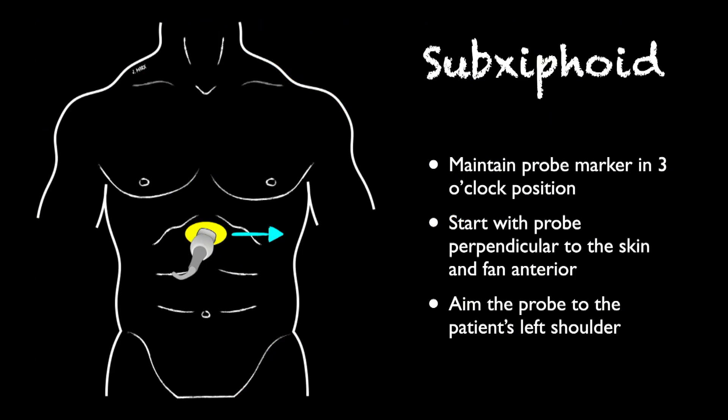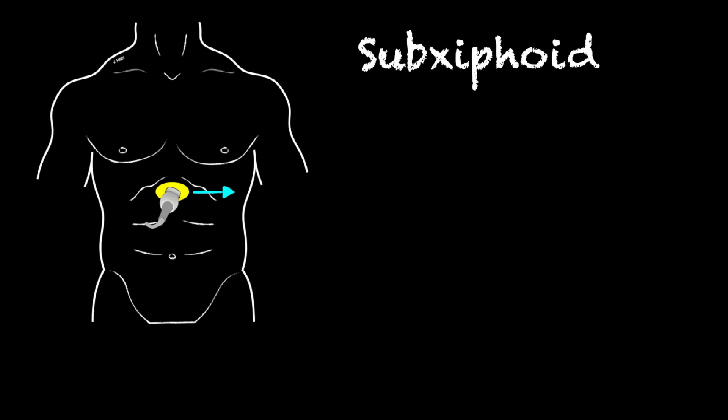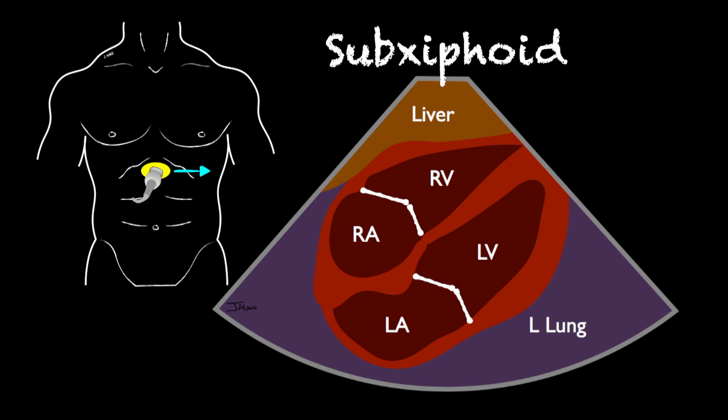To get this view, you want to get your standard subxiphoid view. You put the probe in the subxiphoid position and you're going to fan and angle up towards the patient's left shoulder until you get a view similar to this. What you're going to see at the top of your screen is your liver, and the right ventricle is going to be right up next to the liver. Just inferior to that on your screen is going to be the left ventricle.